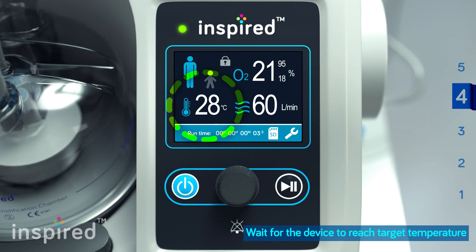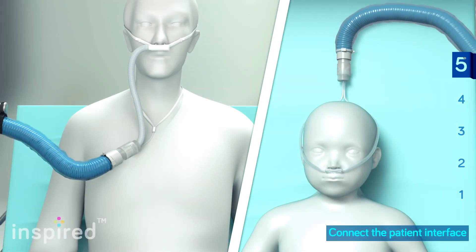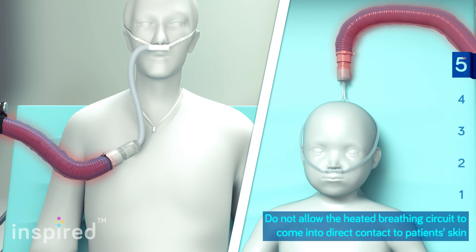Wait for the device to warm up until the set temperature is reached. Connect the patient interface. Do not allow the heated breathing circuit to come into direct contact with the patient's skin for an extended period of time.